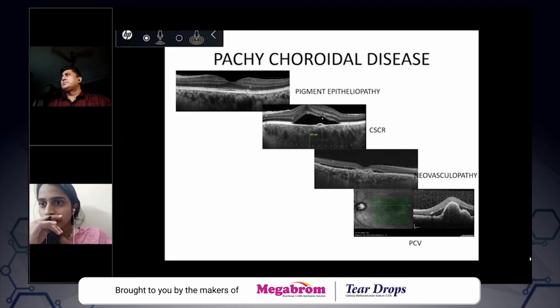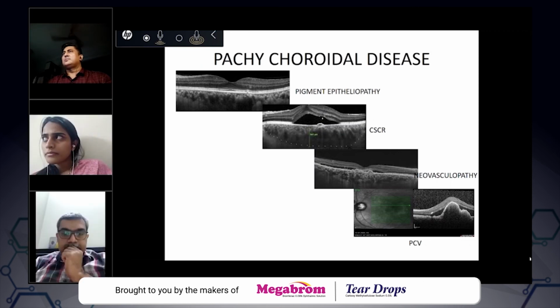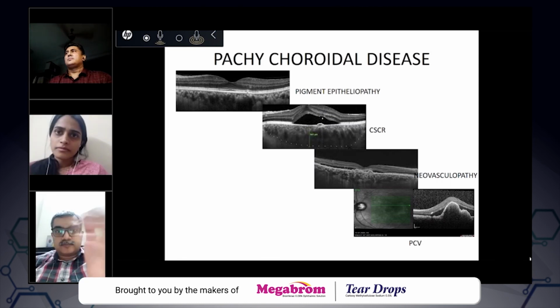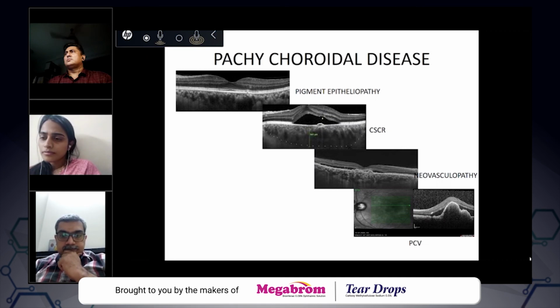Which OCT scan protocol to select in each case, and how can we decide on that? There are innumerable protocols, but the most useful ones are, if you want to take macular thickness, the macular thickness map. For example, in diabetic maculopathy, that was the next part of that lecture. You have to take 3D maps, 3D protocols. Then only you can take volume maps or thickness maps. But otherwise, generally you have to use a raster scan or a radial scan. This will give you very good information.